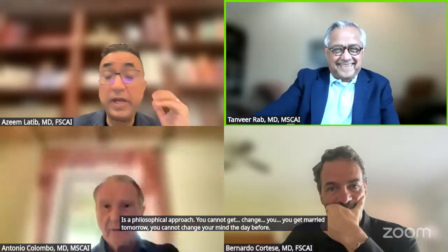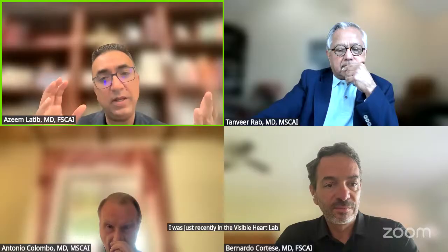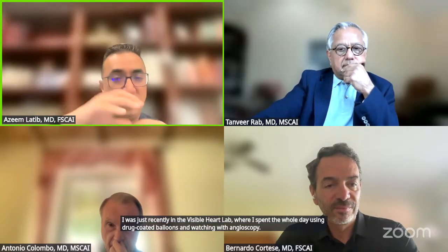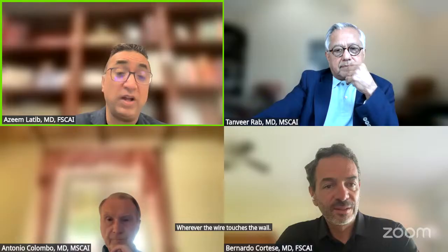So Antonio, actually, there's going to be some data. I'm going to show you guys some pictures soon. I was just recently in the Visible Heart Lab where I spent the whole day using drug-coated balloons and watching with angioscopy. You can see the drug delivered, and it's amazing when you stick an IVUS or OCT catheter, because of the wire bias, wherever that wire touches the wall, you scrape off the drug. Oh, yeah?